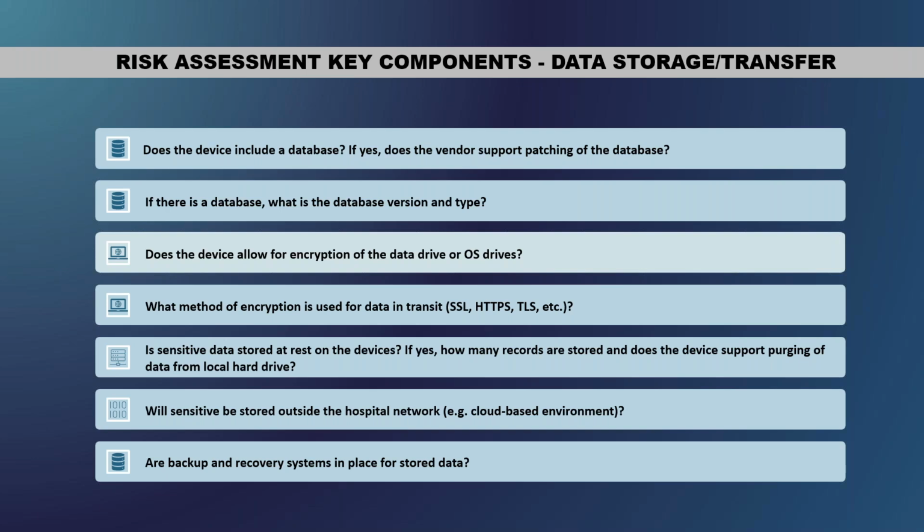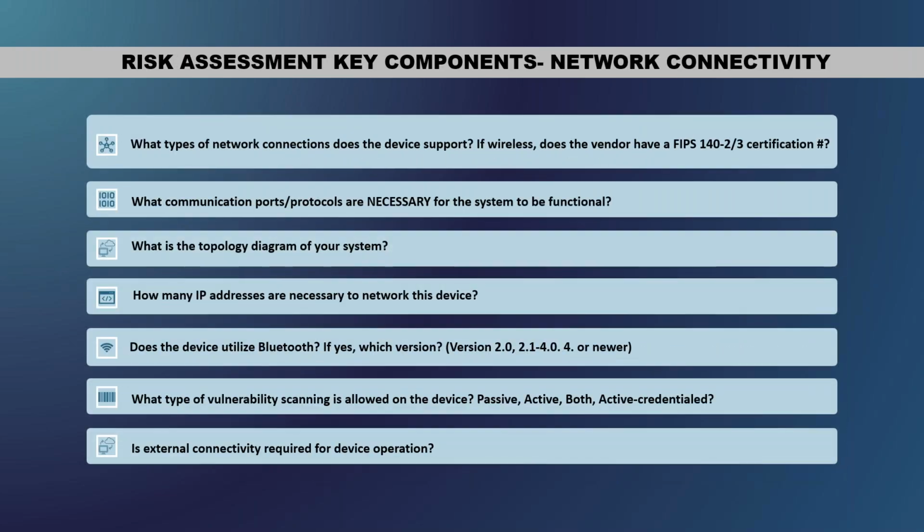And do you have backup solutions? Are there recoveries in place, like if the operating system drive gets corrupted? And where is the sensitive data being stored if it's stored outside, on the cloud? Because then you have to ensure the protection of the data, with the authentication of the cloud-based solution, all that fun stuff. Okay, next. And then it goes into the network topology.